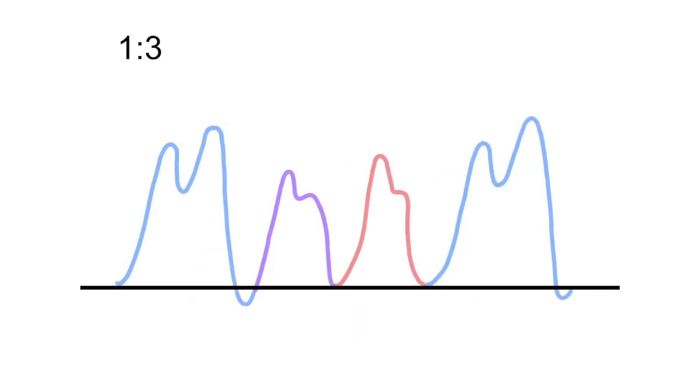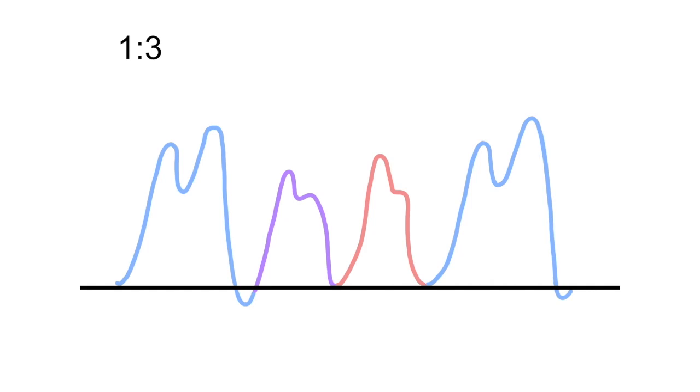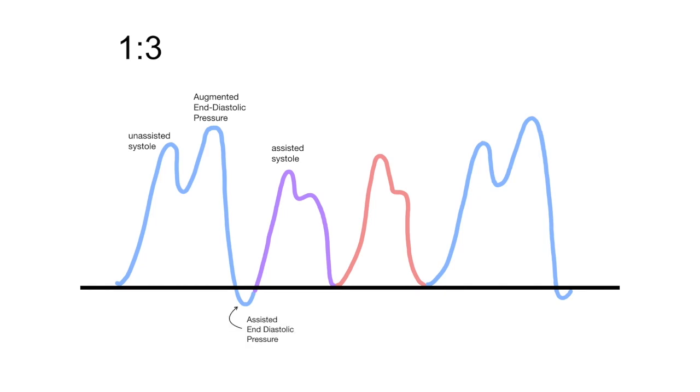One to three timing refers to balloon inflation every third heartbeat and is mainly utilized for weaning. As you can see, we have the augmented end diastolic pressure, the assisted systole, and the unassisted systole. In addition, we see the balloon pump beat dropping below the baseline, signifying that afterload reduction is occurring.